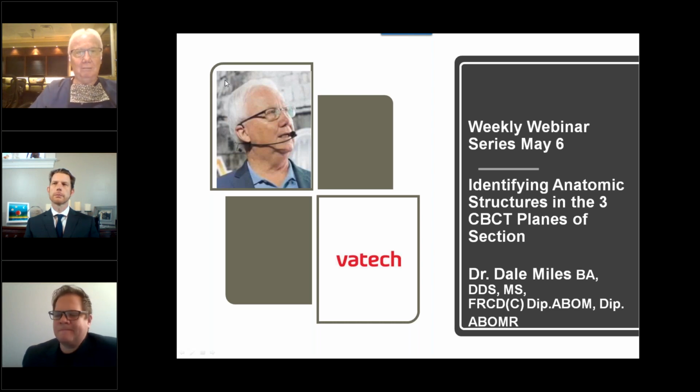But in a small pixel that you can only put one of 256 shades of gray, that makes a big difference. The grayscale images don't look nearly as nice as if you had a big medical grade monitor with higher bit level or bit depth for grayscale as well, because they have to separate those things. They're looking for small changes.